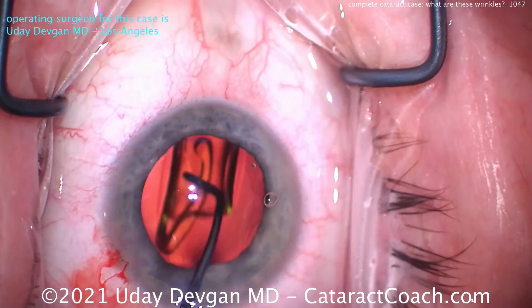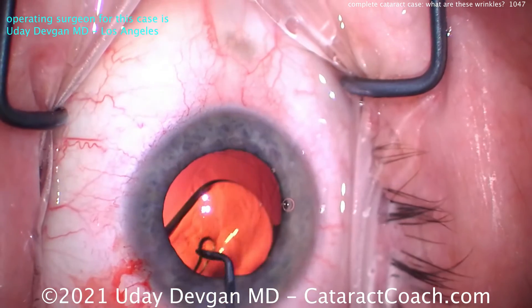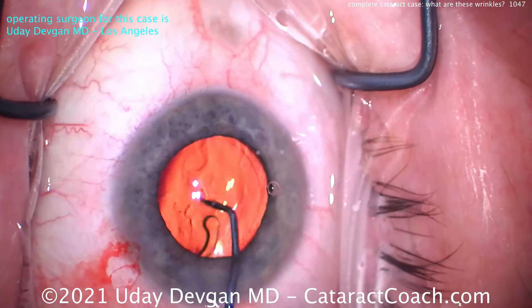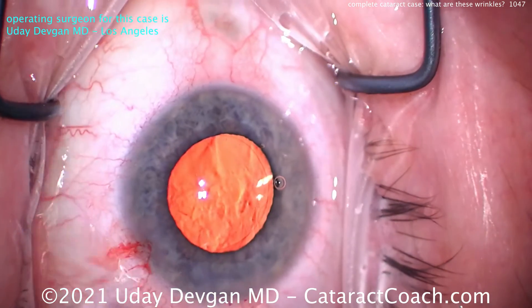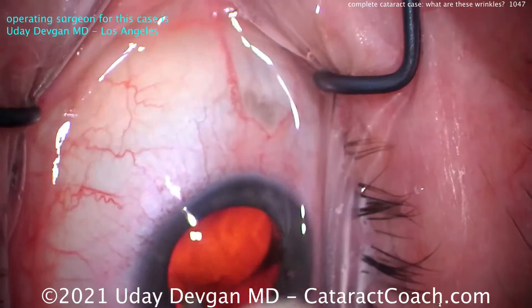Let's get it rotated. Let's see our rhexis size — how did we do on our capsulorhexis? It looks pretty good, I'll take it. Get that last haptic unfolded — a little sticky there, that's okay, we'll just use the chopper to help. There it goes, now it's released. Get this rotated a little bit more to make it a little easier to get the IA probe under the optic. Here comes the IA probe for the viscoelastic removal.